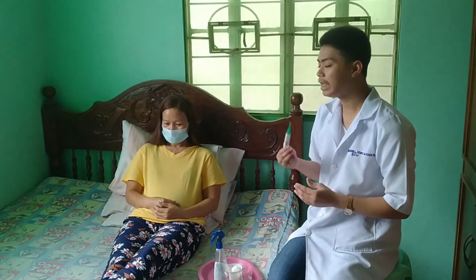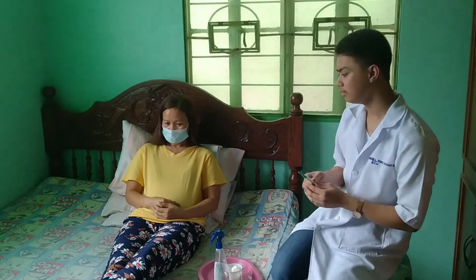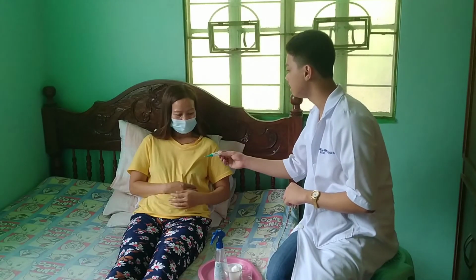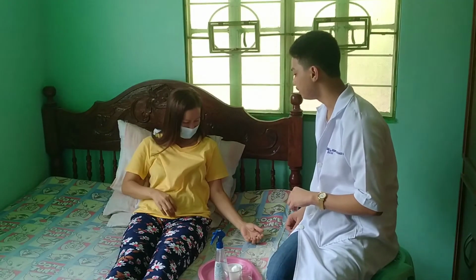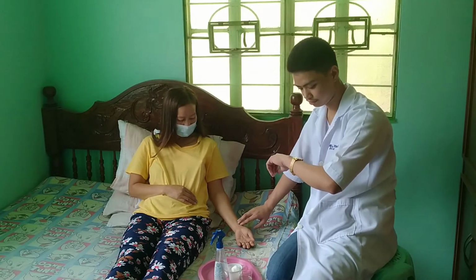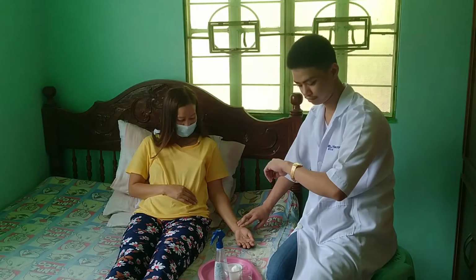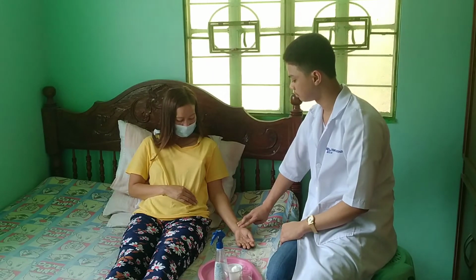Next, while taking the temperature, I will take the pulse rate of the client using 3 fingers. The rationale behind the 3 fingers is to para mapakinggan po natin ng maayos yung pulse po ng patient po natin. Palagay na lang po ito sa inyong axillary. Count the pulse rate of the client for 60 seconds. Also assess the pulse rhythm and volume of the client.